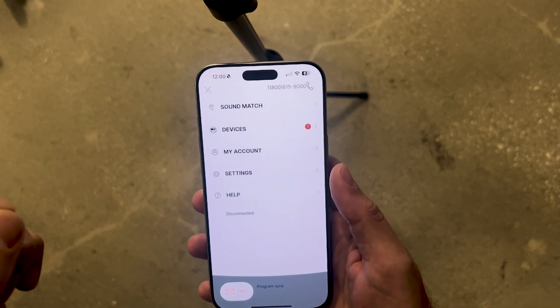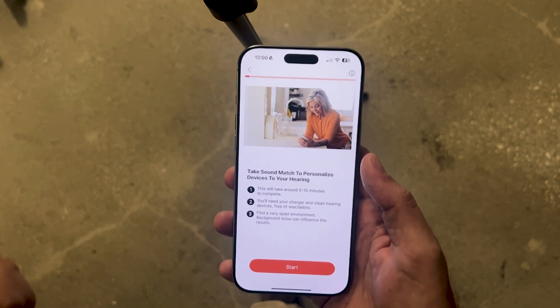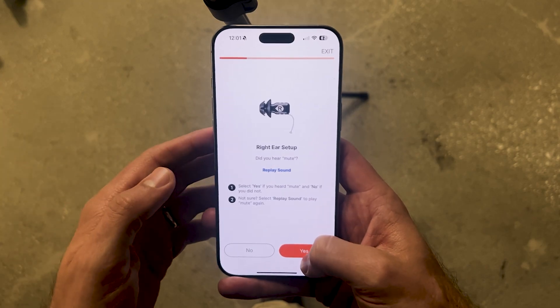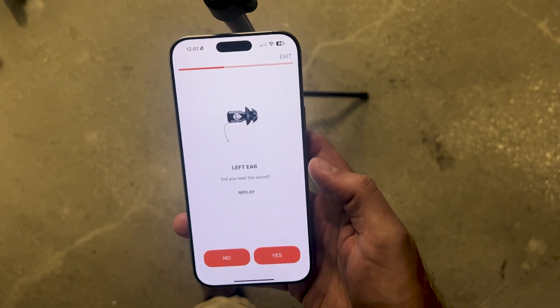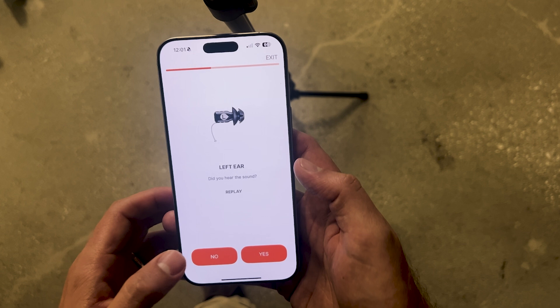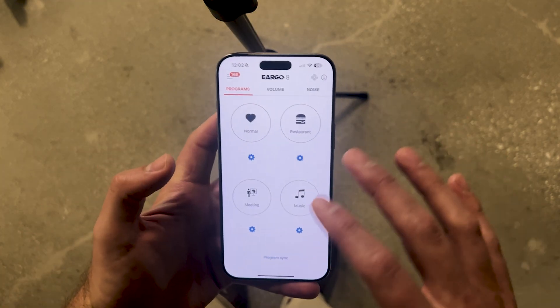Now let's dig into the setup for these devices. They're set up through Soundmatch. I've already gone through this process, but I'll take you through it again so you can see how it works when you first set up your hearing aids. It'll take you through a few steps: you'll need to increase your volume, place the devices in your ear, and follow the prompts. You'll hear the word 'mute,' confirm that, and Soundmatch will begin. You'll hear a series of beeps — right now focused on the left ear — and simply answer whether you heard each one or not; you can also hit replay. Once you've gone through the Soundmatch profile, your hearing aids will be programmed to match your particular hearing loss, and you'll find yourself back in the main app settings.